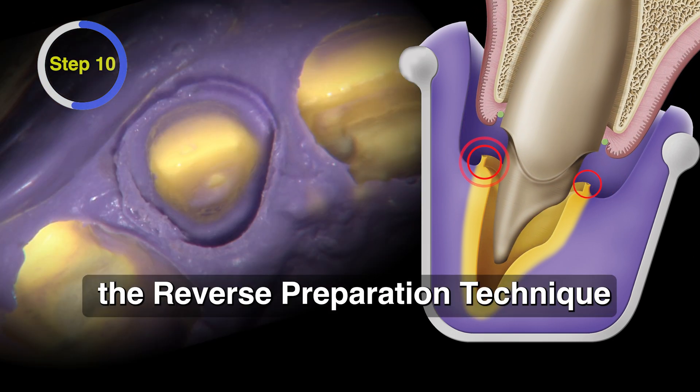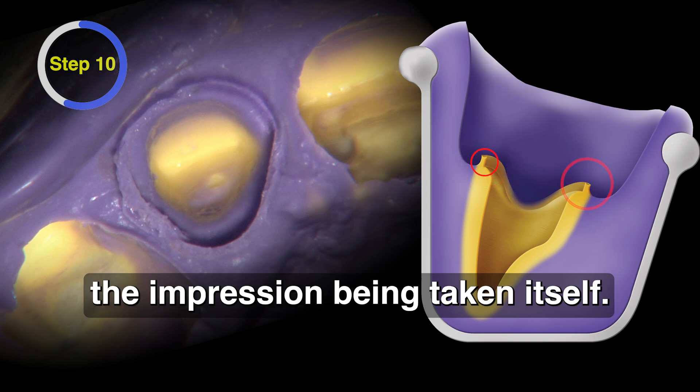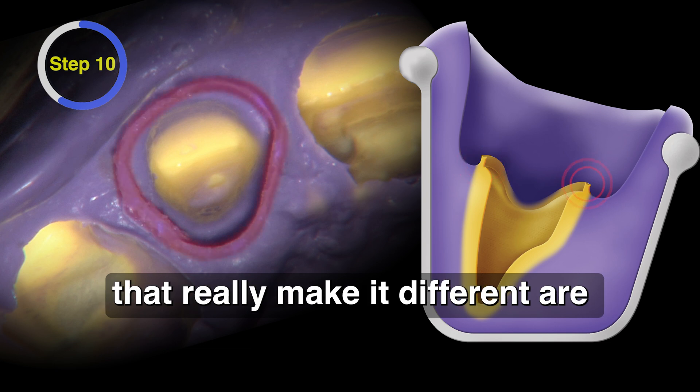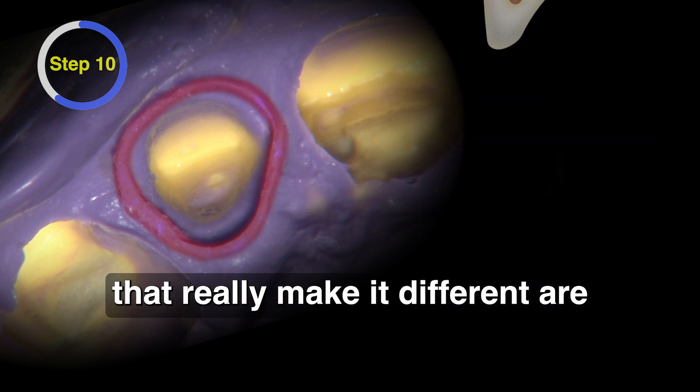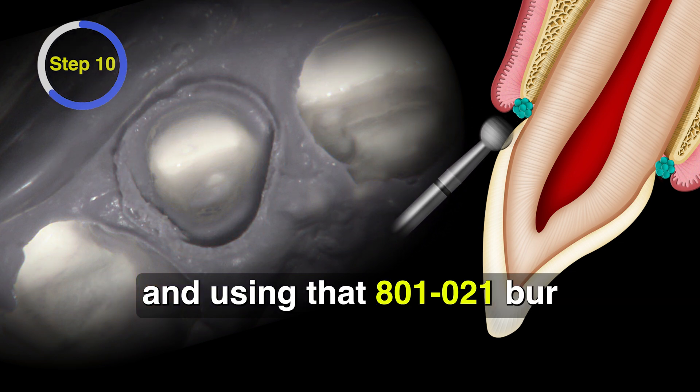So that's the reverse preparation technique and all of its steps, ending with the impression being taken itself. The key points that really make it different are prepping the gingival margin first and using that 801-021 burr.